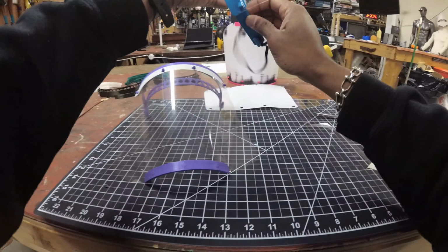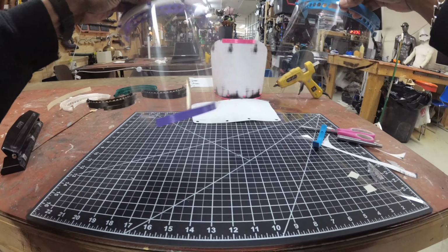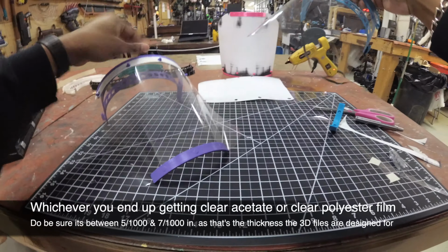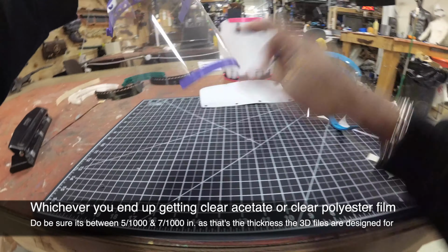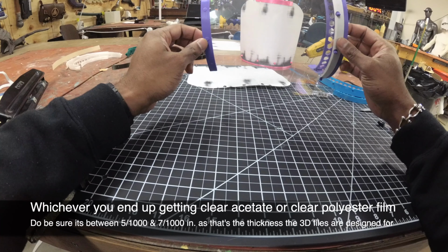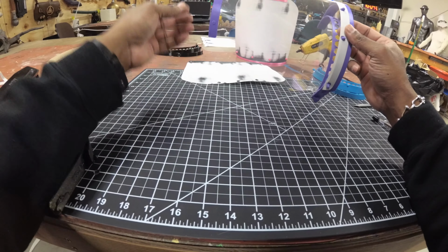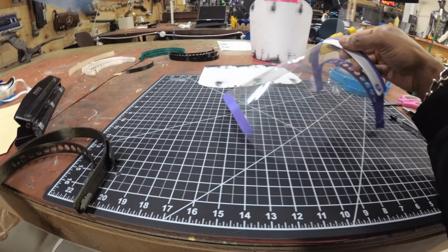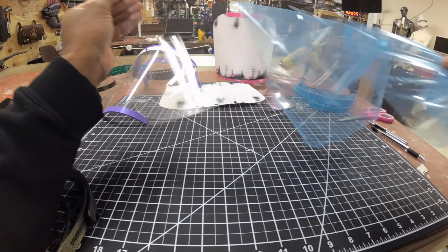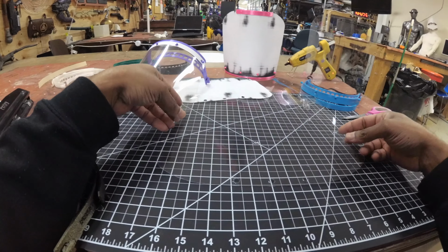If I were to do that with this one with it off, you can hear it. This one, you barely hear it. Okay. So it has that flex there, whereas this one, not so much. So don't use any vinyl because that tends to be a little too floppy, and it's definitely not as clear as the acetate or the polyester film. And you can even use PETG. There are PETG sheets just as clear as the others. It's a lot more durable as well.